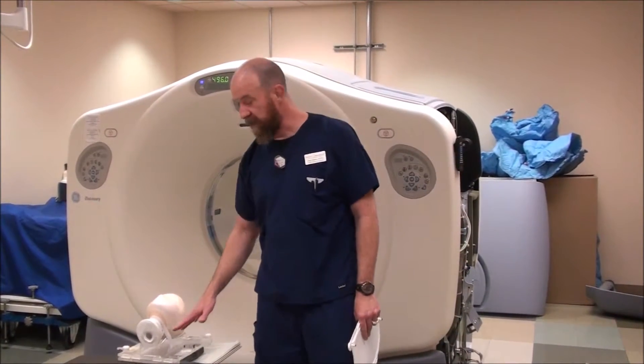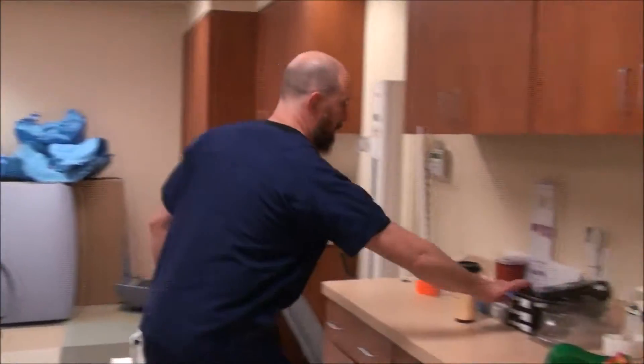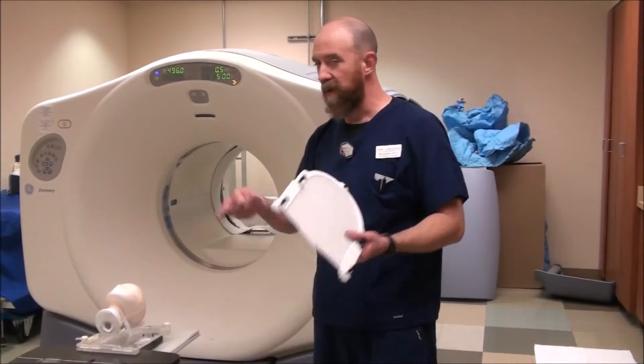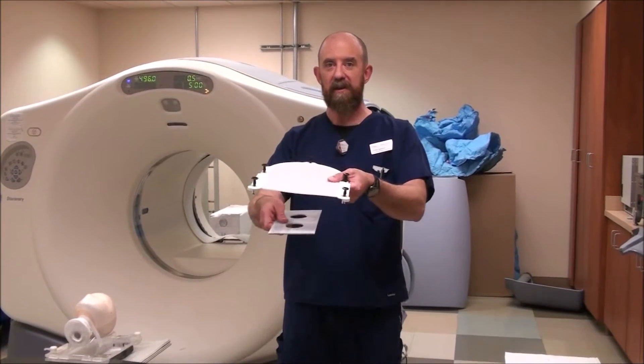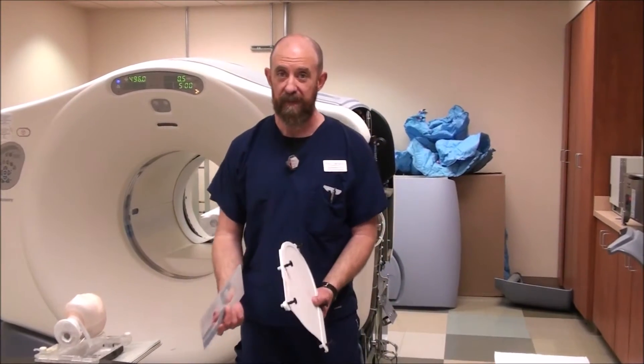Another thing — when you put the headrest down, you want to use a shim underneath the headrest. For instance, this is an example of a shim for another headrest system. It's basically a piece of plastic that makes the patient virtually thicker than they would be otherwise by two or three millimeters. That allows the mask to shrink that two or three millimeters and not be so tight on the patient that they can't wear it next week when they come back in for their treatment. So what you want is the shim — it actually makes the patient thicker so when you make the mask and then it shrinks and you don't have the shim in place anymore, it actually fits without being painful.